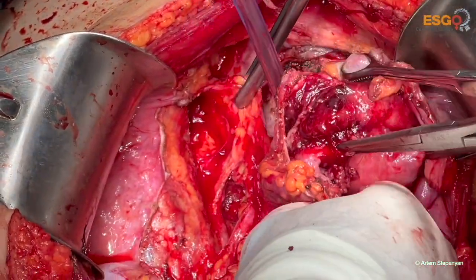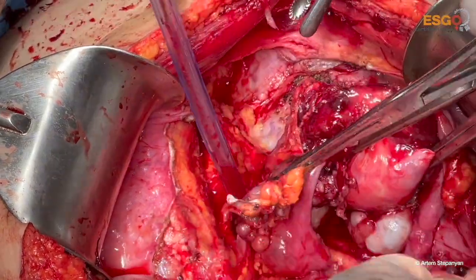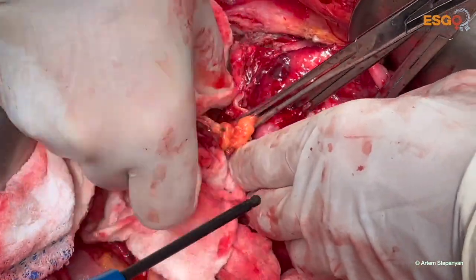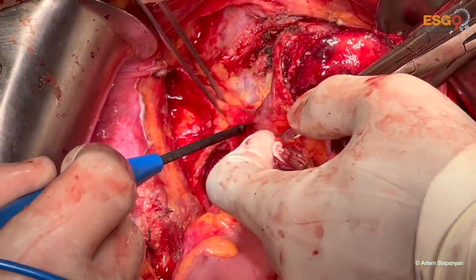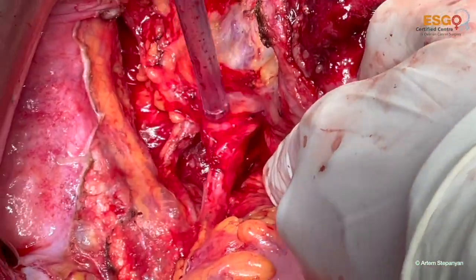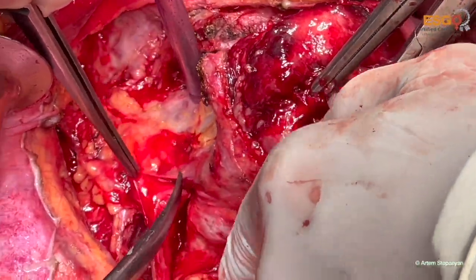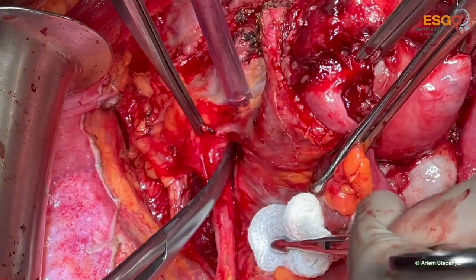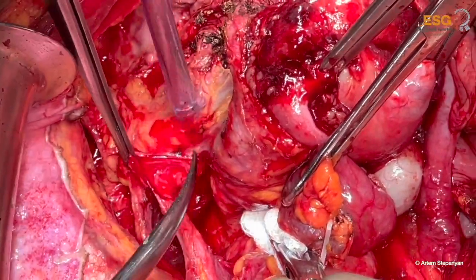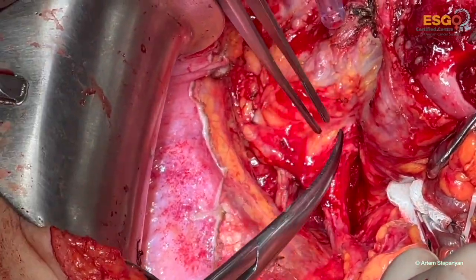Now we can move to the left ureter and the left uterine vessels. Here we see the ureter going in the ureteric canal just under the uterine vessels. Again, we use the cold scissors for this step.